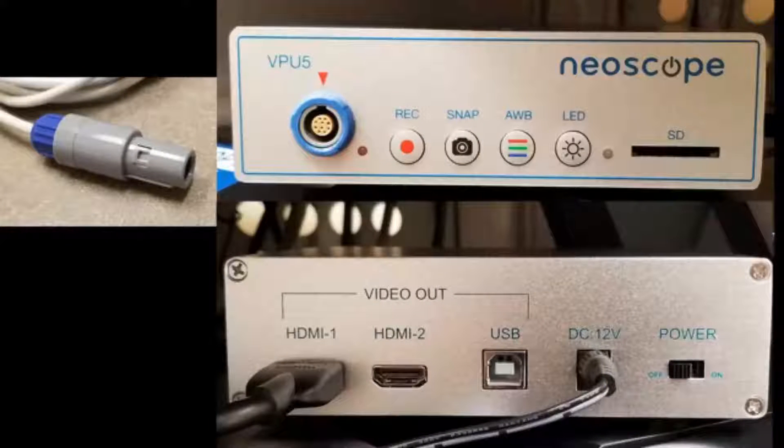The record button starts a video recording, snap takes a still picture, automatic white balance is the next button, and the LED adjusts the intensity of the light at the end of the urethroscope. The SD slot is where you can insert an SD memory card to capture images. The bottom photo is the back of the VPU 5, which features two HDMI outputs and a USB output so you can plug into a computer or tablet to display images. The power goes into the DC 12-volt input plug, and the power switch is to the far right.